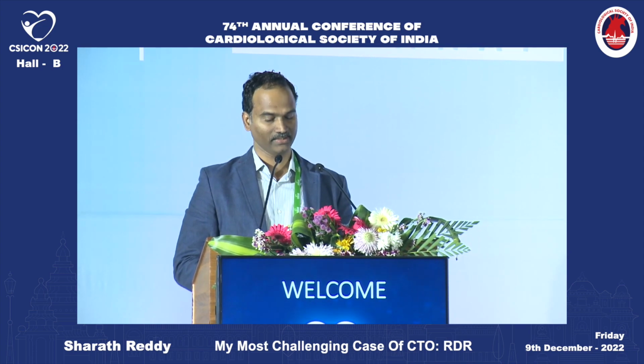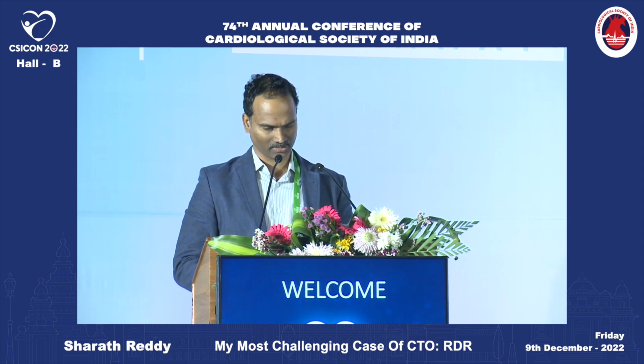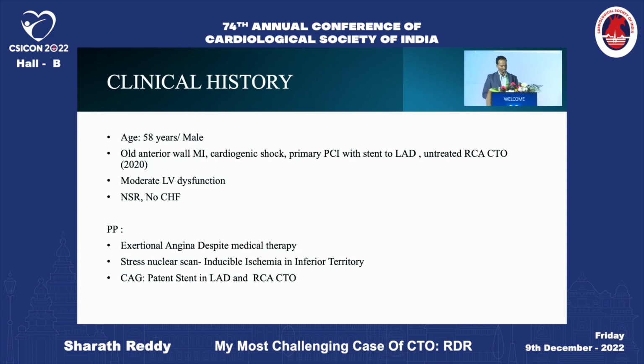with stent to LAD. At that time itself, there was an RCA CTO, but not treated subsequently. He has moderate LV dysfunction and is not in decompensation. So this patient came with exertional angina, progressively increasing despite optimal medical therapy, and stress nuclear scan showed clearly inducible ischemia in complete RCA territory. And this is after 2 years of primary PCI.